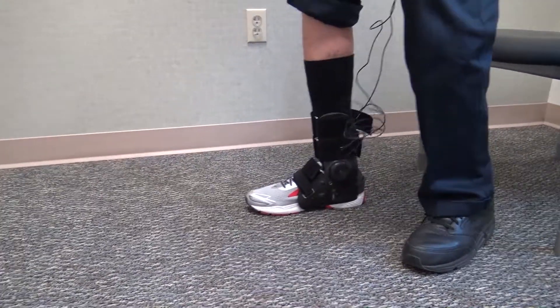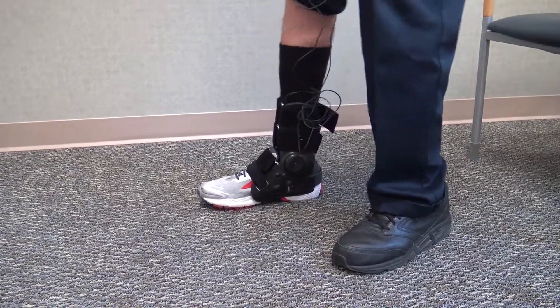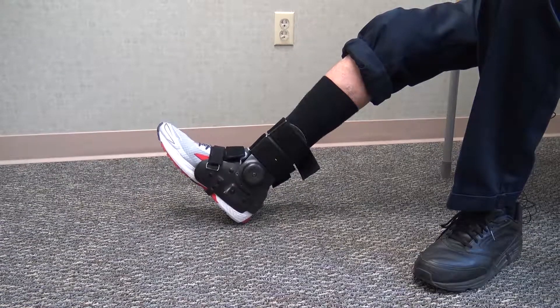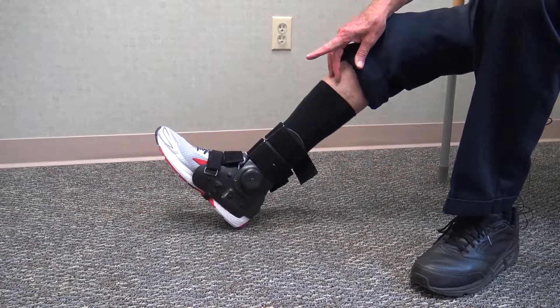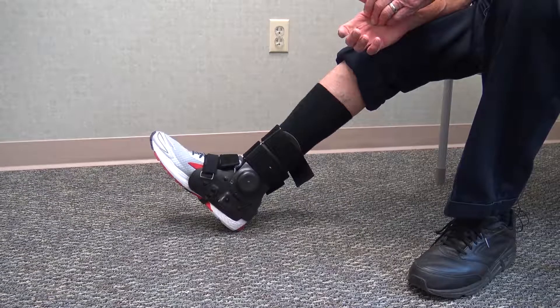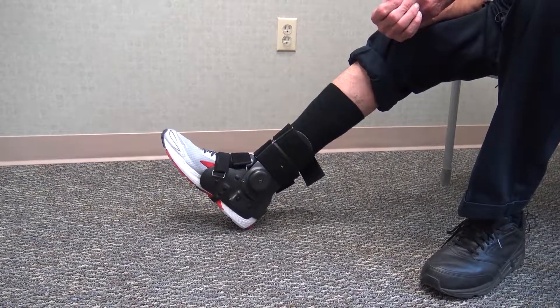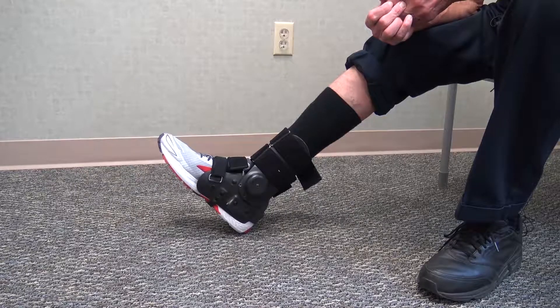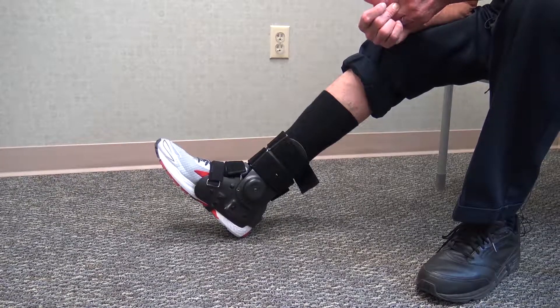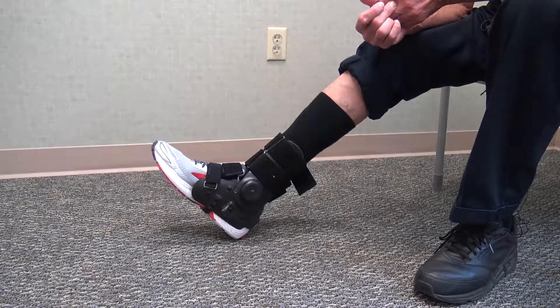So when you walk with the locked version, you go boom, boom, boom, boom — that's because it's locked; you don't want to try to do a heel-toe walk. Basically, that's the fitting of the brace. It should be comfortable — you may need a heat gun with thin jogging shoes, but with a work boot you'll never need one. With codes L1971 and L2820 (the acute brace), you always have to bend it a little bit. If there are any other questions, feel free to call Dr. Fred Ferlich at 574-286-2273, or call Cliff at SureStep Midwest on the customer service line on the order form. Thanks so much.